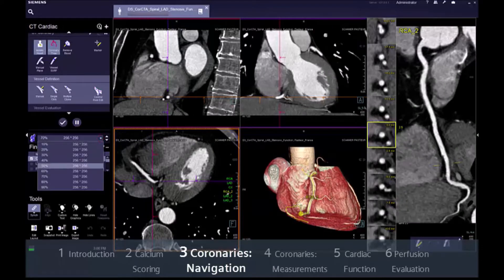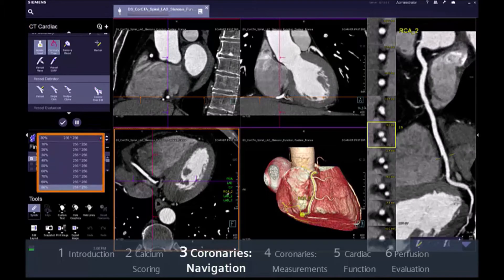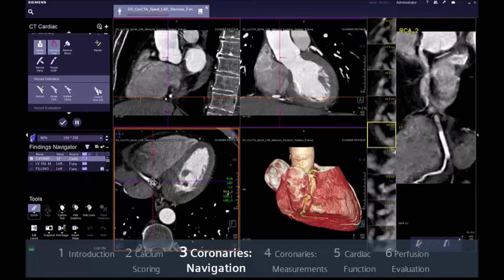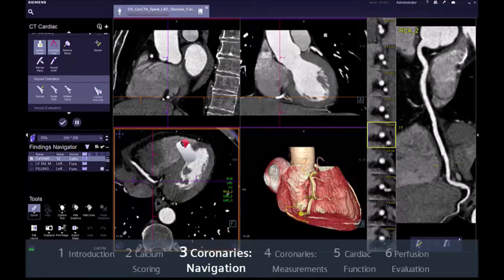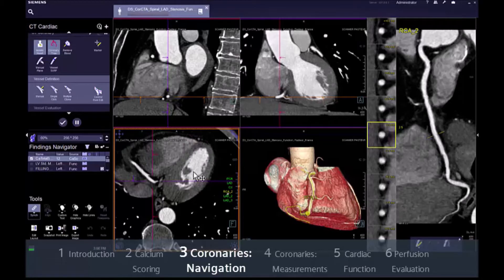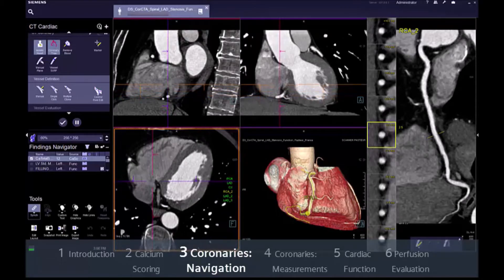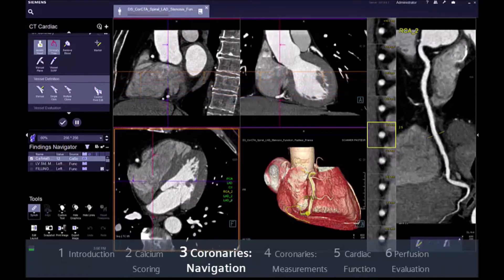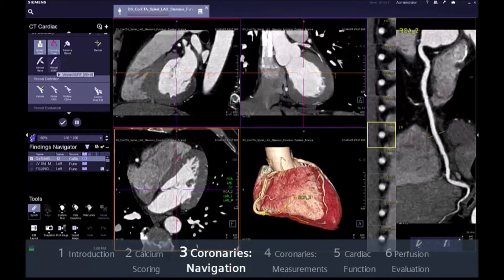You can easily check the individual phases by selecting them from the drop-down menu or, more conveniently, by right clicking and dragging the mouse horizontally over the CPR segments. This will help you find the series with the least motion for the different coronaries, which is especially useful for reading challenging cases or in occluded vessels.